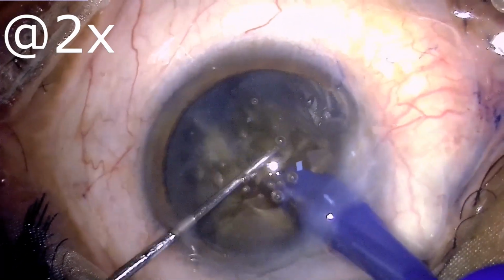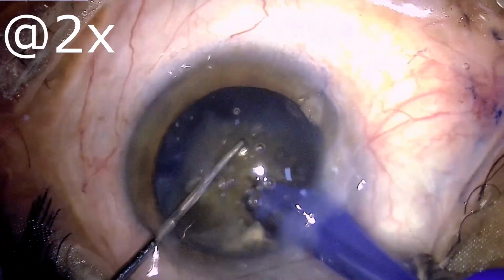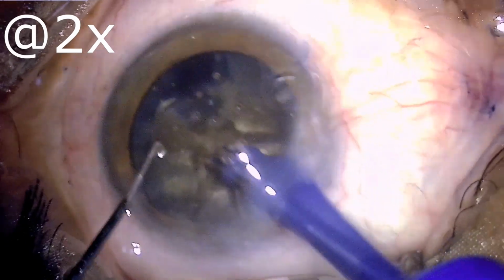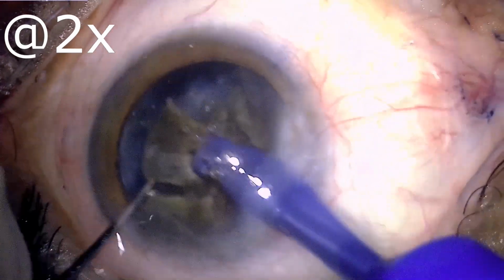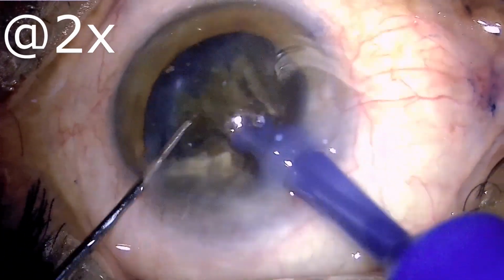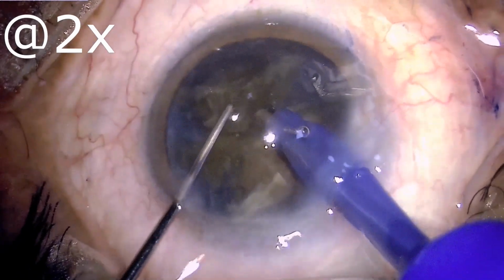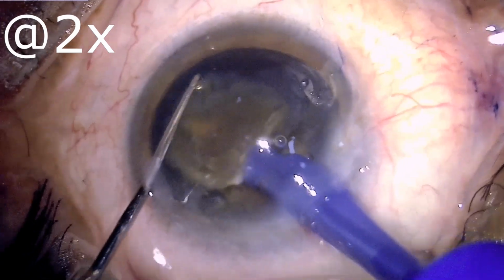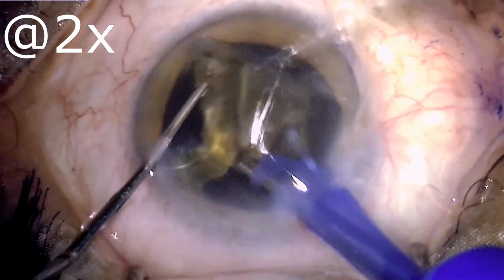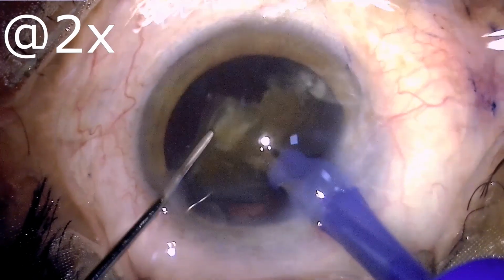phacoemulsification in such hard cataracts is that usually the inhibition is about burying your phaco tip deep into the nucleus, and that is something which causes formation of a posterior backbone of the nucleus which remains there and keeps the pieces being held together. So the most important thing is to reach deep into the core of the nucleus when burying your phaco tip so as to get a good purchase, and that will be helpful in providing you the complete separation of the fragments.